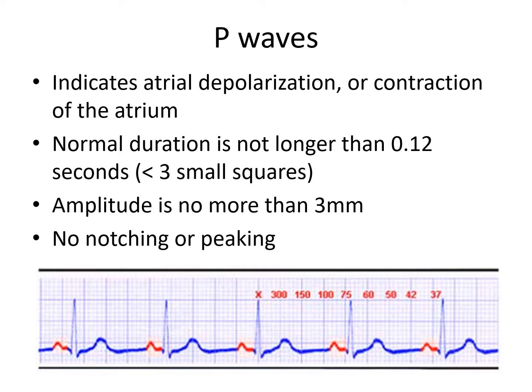Also, for a sinus rhythm to be present, we also need to meet another condition, and that is that the heart rate must be between 60 and 100 beats per minute. And finally, all the QRS complexes will be the same shape. In this slide, it's very nice because we see all the P waves are in red.